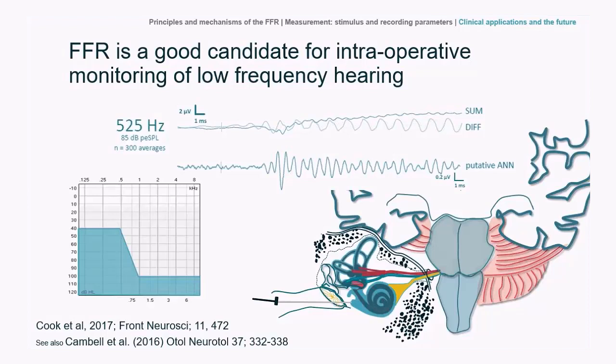Here we have a reference to a paper by Cook and others showing the potential for, at least in this case, transtympanic recording sites to pick up a neurophonic response within just a few hundred sweeps, which should be very close to real time in the period of time it takes to obtain that, and therefore give feedback, for example, to the surgeon about the course of the surgery and the efforts to preserve low frequency hearing. So that's one potential clinical application.